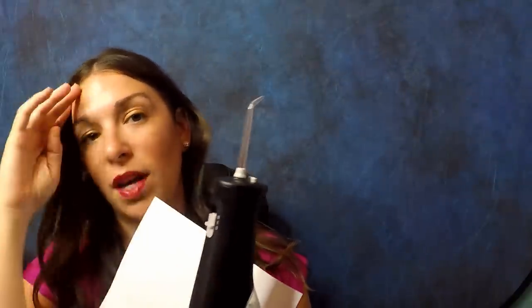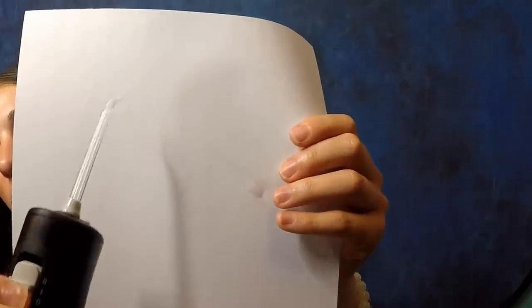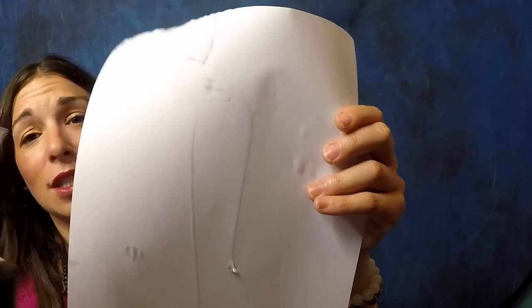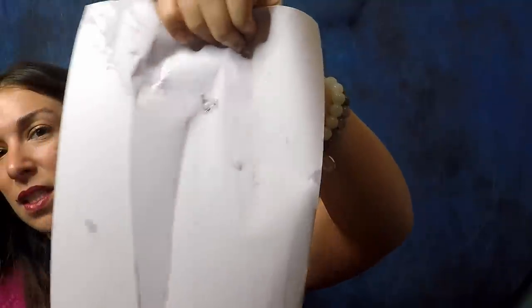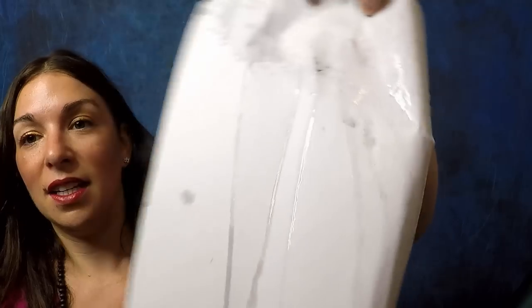Now let me get a different piece of paper and show you the Waterpik. This is going to be a continuous stream of water. When I first turned it on I actually test-sprayed it in the shower — it goes very, very far — so I'm going to do this over a bowl. Okay, you can see it's just a continuous, continuous stream of water going everywhere.